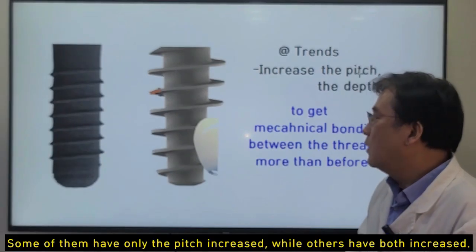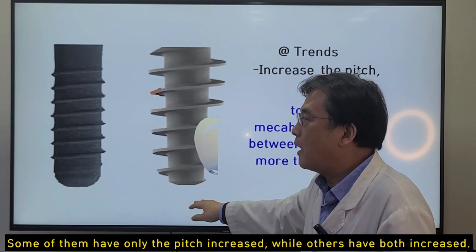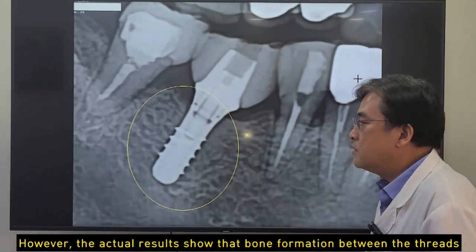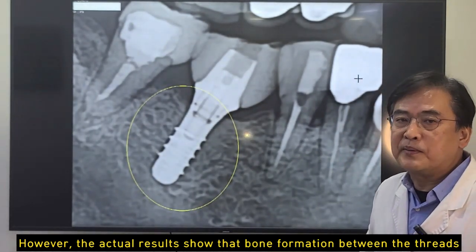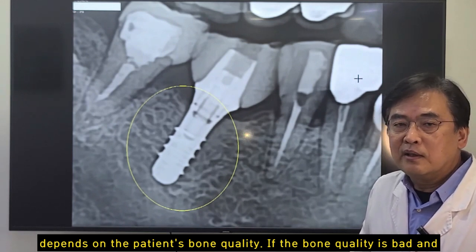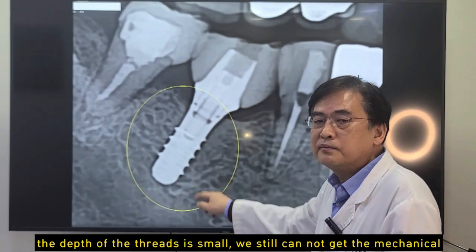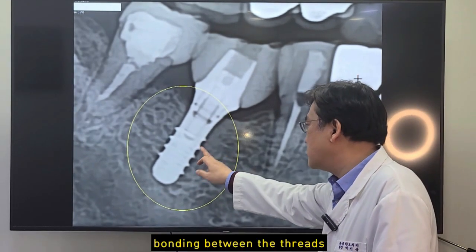Some of them only have the pitch increased while others have both increased. However, the actual results show bone formation between the threads depends on the patient's bone quality. If the bone quality is bad and the depth of thread is small, we still cannot get the mechanical bonding between the threads.